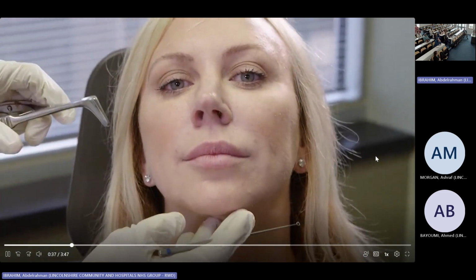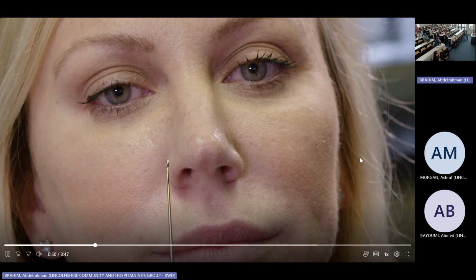And so what we typically do is we'll put her head back here and I'll watch her breathe. And what you see here very clearly, breathe in again, is you see this whole sidewall of her nose move medially. And what that means is there's weakness in the lateral wall, it's collapsing into her airway and blocking it.